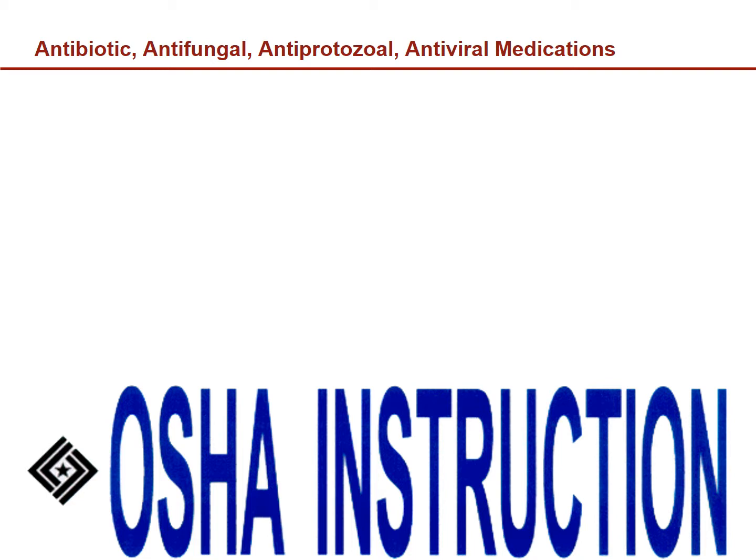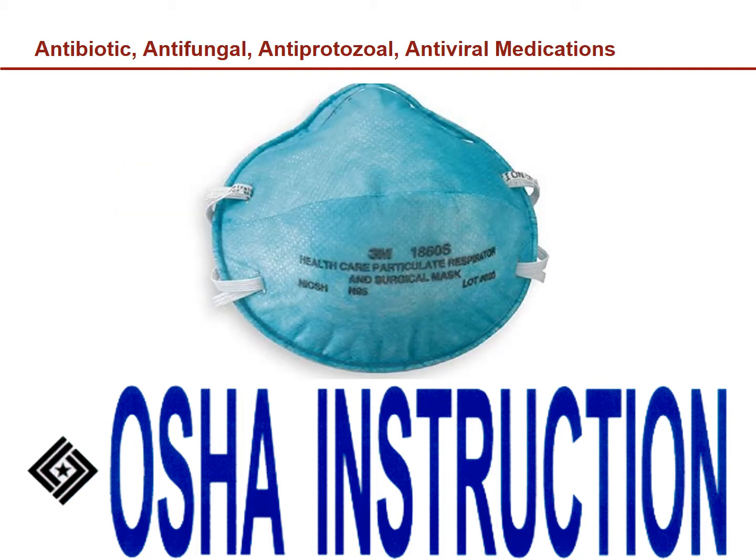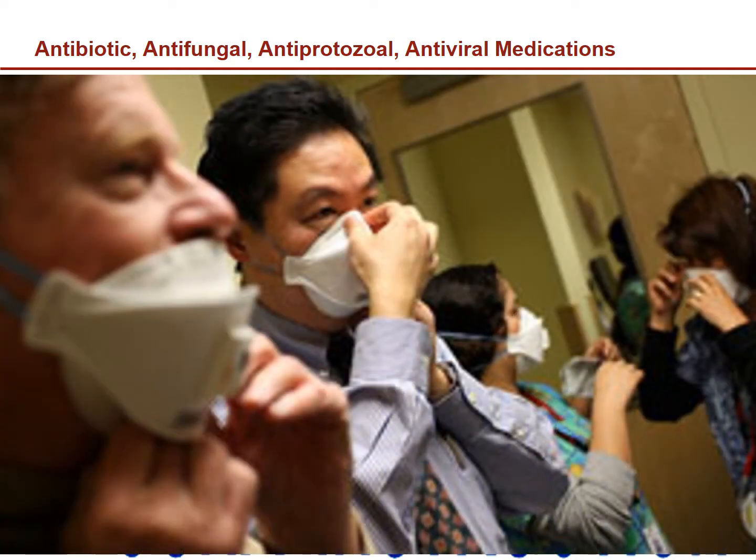Secondary exposure can cause eye irritation, can irritate or numb nasal passages, or exacerbate asthma. Therefore, OSHA instructs caregivers to wear an N95 mask or a CAPR during the nebulization of any of these medications. Visitors should be asked to leave the room during administration with these types of medications. If visitors choose to stay in the room during nebulization of antimicrobial agents, they should also wear an N95 mask.